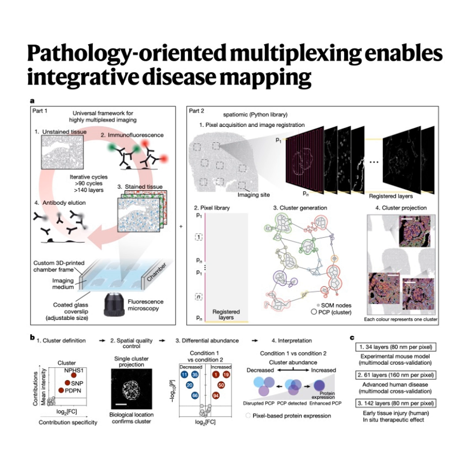Nasty stuff. What did PathoPlex reveal? The data analysis using Spatiomic spat out dozens of these clusters, these biological signatures. But one cluster, designated cluster 21, consistently popped up. It was significantly increased in the mice during acute kidney injury, and even more so as the disease progressed to full-blown CGN. And what defined cluster 21? What was its molecular fingerprint?